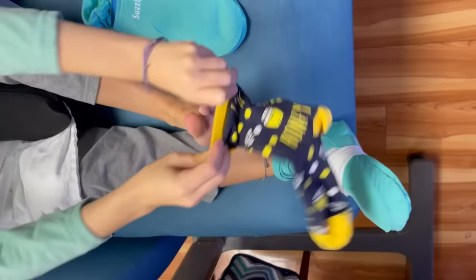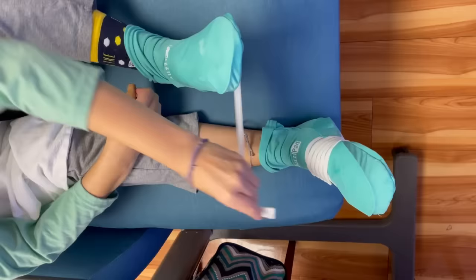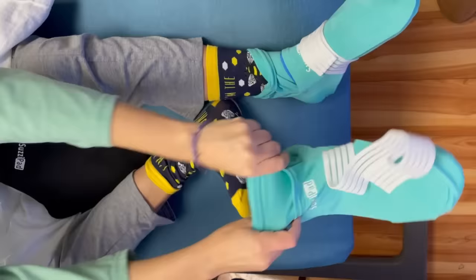Now that we are halfway through the infusion, it is time to replace the ice packs. A trick for if your feet are just getting really cold: I brought along two pairs of socks — one pair for my feet, the other pair to put on my hands to go underneath the mittens. Your feet still stay cold, your hands still stay cold, the ice is still working — it just gives a little extra cushioning between the cold if you're feeling like your hands and feet are getting overly cold.